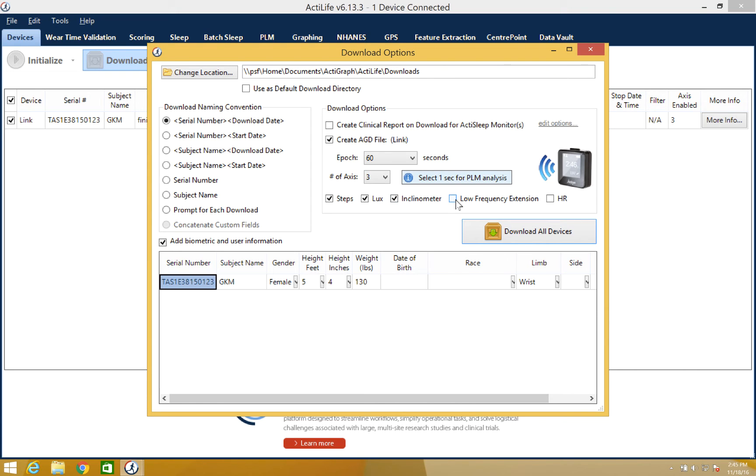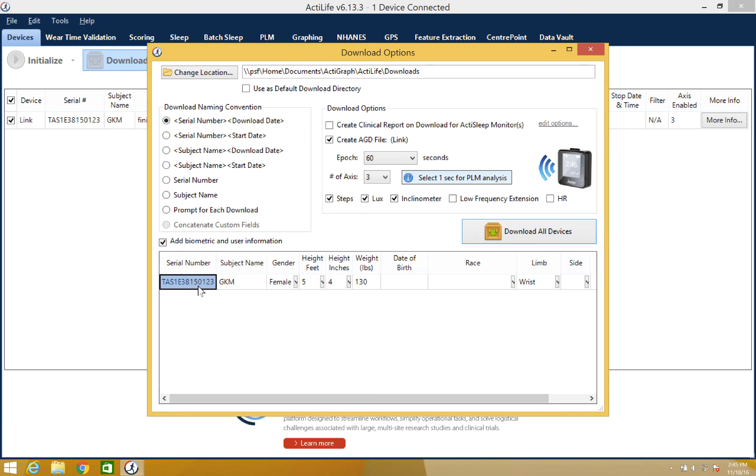With the download option set, you can now add or edit subject information by checking the box next to add biometric information. You will then be able to alter these parameters as needed. The device is now ready to be downloaded. Simply click download all devices to proceed.